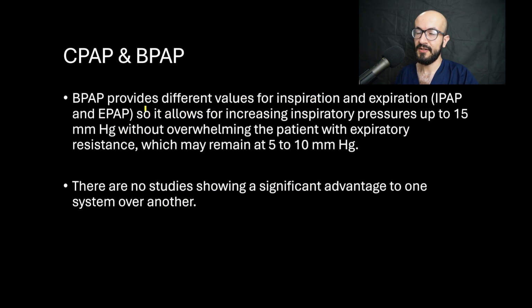On the other hand, we have bi-level positive airway pressure ventilation. CPAP is the older technology and BiPAP is the newer technology, and it provides different values for inspiration and expiration pressures. You can choose a pressure for inspiration and a pressure for expiration. The inspiratory pressure is called IPAP and the expiratory pressure is called EPAP.